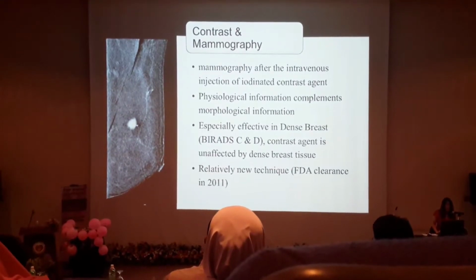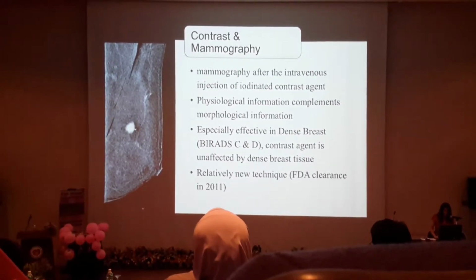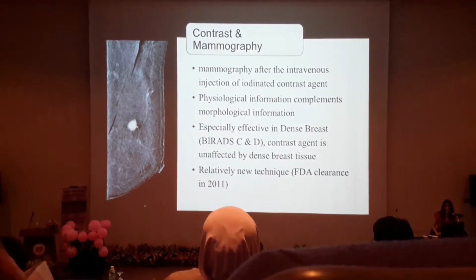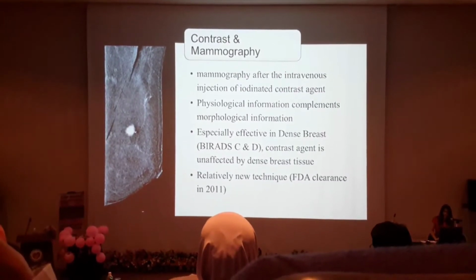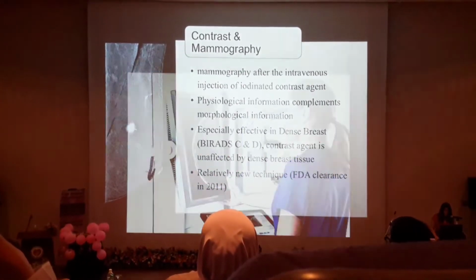Basically, it is a mammogram done after IV injection of contrast media. So it is a relatively new technique with FDA clearance as recent as 2011. It provides us physiological information from the increased uptake of contrast in a tumor, and it complements the morphological information obtained through mammograms. Additionally, it is unaffected by the density of the breast.